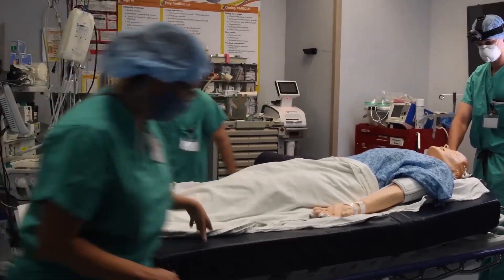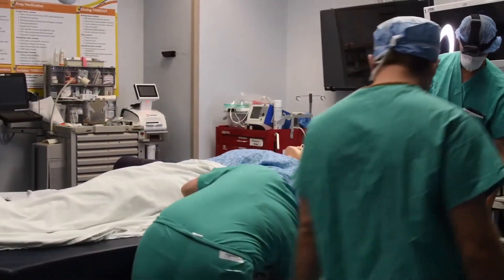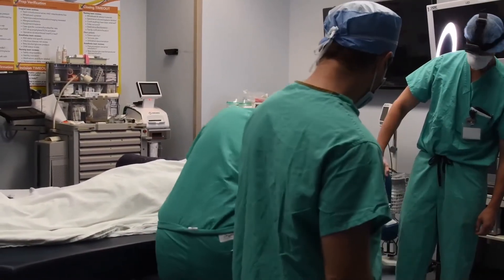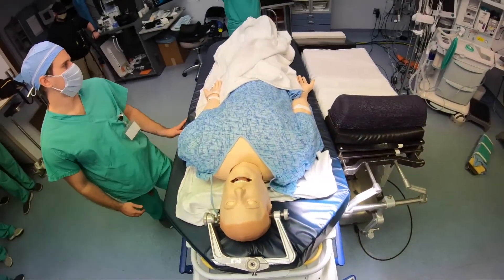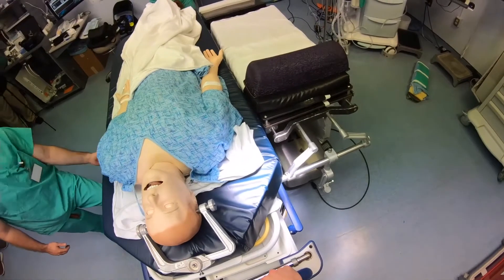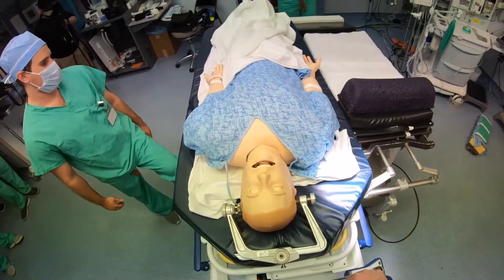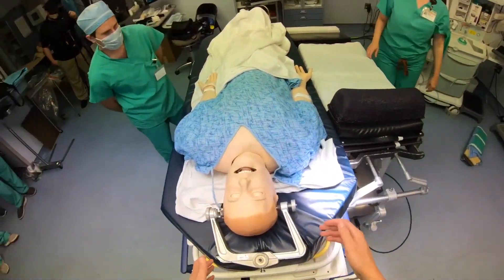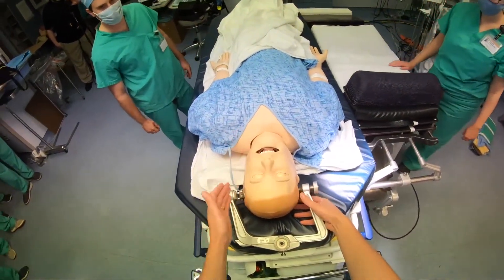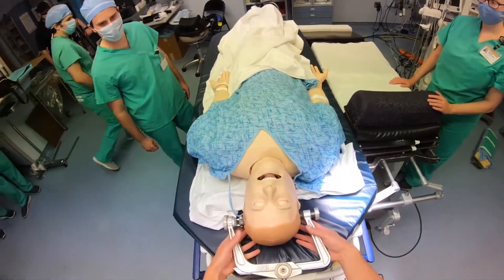The way you do that, at least on these stretchers, you can see at the bottom there are little label diagrams — you want the one with the air going up. You're going to need more help than normal to roll the patient because someone's going to have to be on airway, someone's going to have to be watching the pins, and then several people depending on how big the patient is to help with the body.